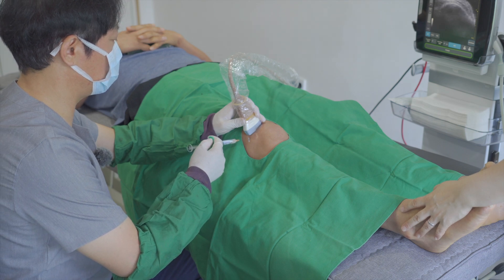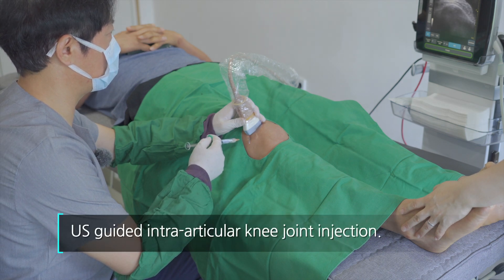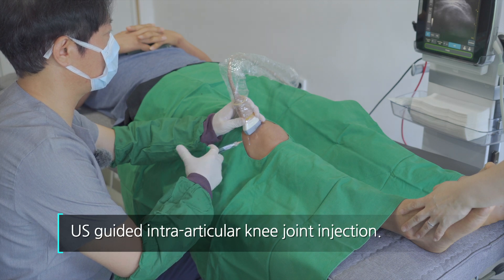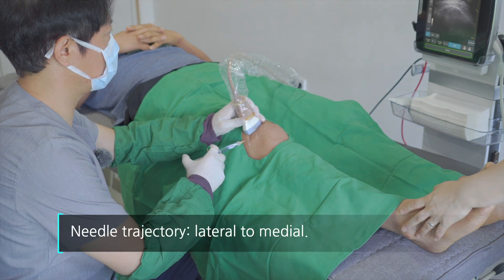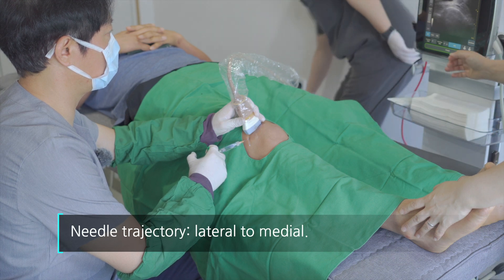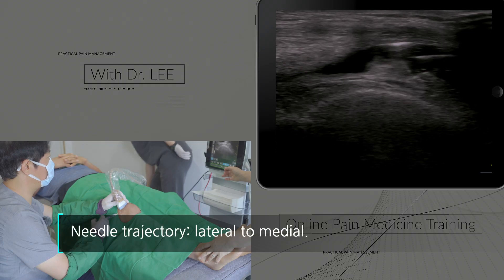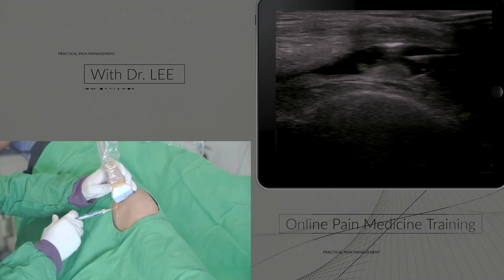This approach is the ultrasound guided intra-articular knee joint injection. I put the needle at the lateral aspect of the knee and approach the needle from lateral to medial posterior.